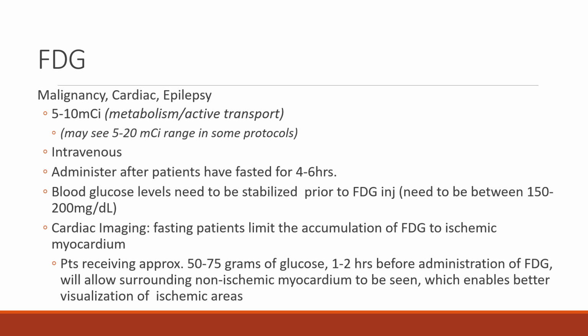And so at that point, fluorestradiol, for example, is going to be having a lot of hormone receptors on the surface of its cell, and it's going to be hormone mediated. And so you might see it get taken up a lot on a fluorestradiol study. And then maybe you do an FDG and you don't see that. That's because those tumors are not metabolizing sugar. They're metabolizing those hormones, and they're using other things to grow and multiply.